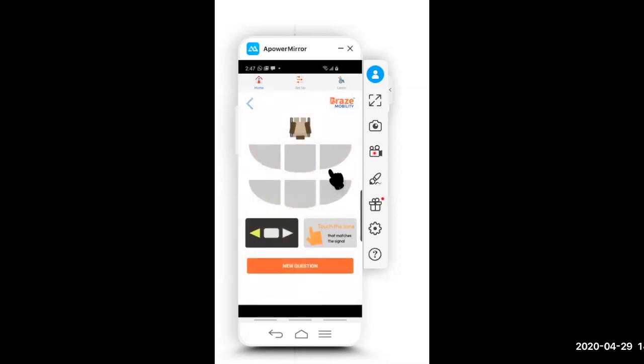Here, now you notice everything's been grayed out, so there are no color cues anymore. Now the person has to figure out not only where the obstacle is in terms of left, middle, or right, but also how far away it is. So is it in that danger zone or is it in the warning zone? Now if I see this yellow left triangle, it means it's further away, so it's going to be in that lower quadrant there. And it's also on the left. So I'm going to click on there and that's correct.